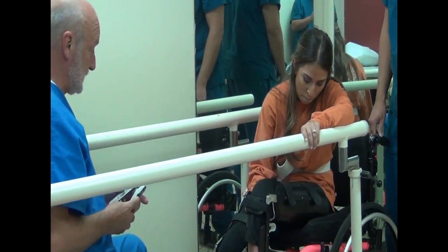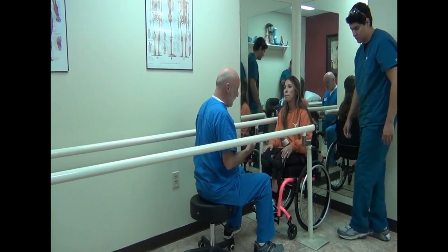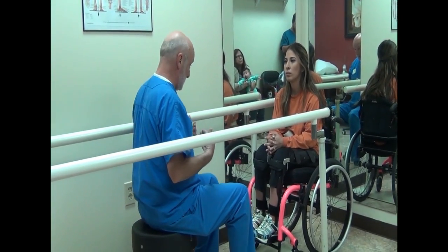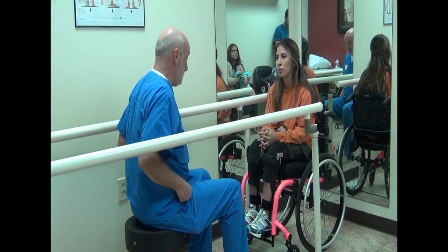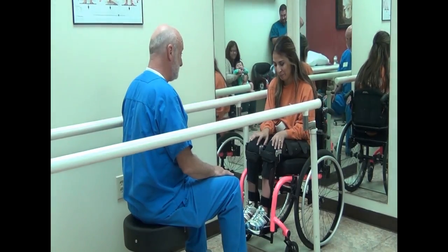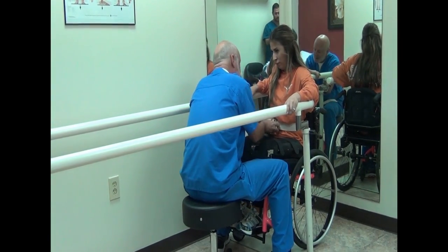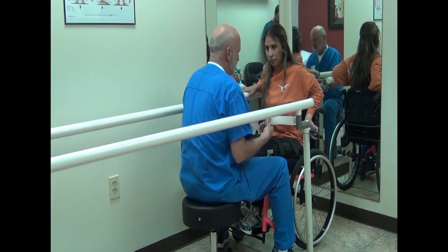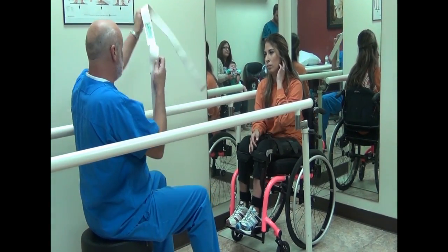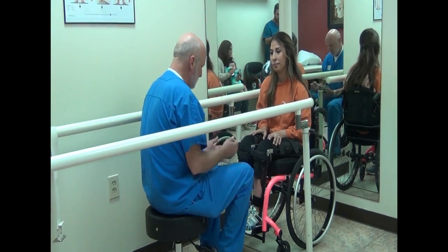Go ahead and position your legs in the chair. Typically, how people work with these is they wear the braces when they get where they're going or when they want to walk, then slide forward on the chair and apply the device. If you're wearing this under your clothing, you'll have to go into a restroom, pull your trousers down, clip it in place, then pull your trousers back up. But leggings are the best way to go. So what do you think? I love them. Good — I'm glad you like them. You've got to keep an eye on your skin — you don't want to wear these more than 30 minutes to an hour at a time without checking your skin the first several times. Then you can slowly increase wear times, but we really want to watch the skin because you have decreased sensation. Redness should clear up within 20 or 30 minutes.